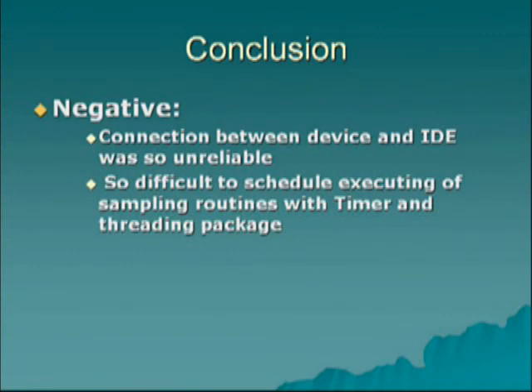We had these negative conclusions. The connection between the device and the IDE was so unreliable, and we had a lot of disconnections between the device and the environment. We had to update the image on the device several times, and it was also very difficult to schedule the execution of the sampling routine with timer and threading package on the system.